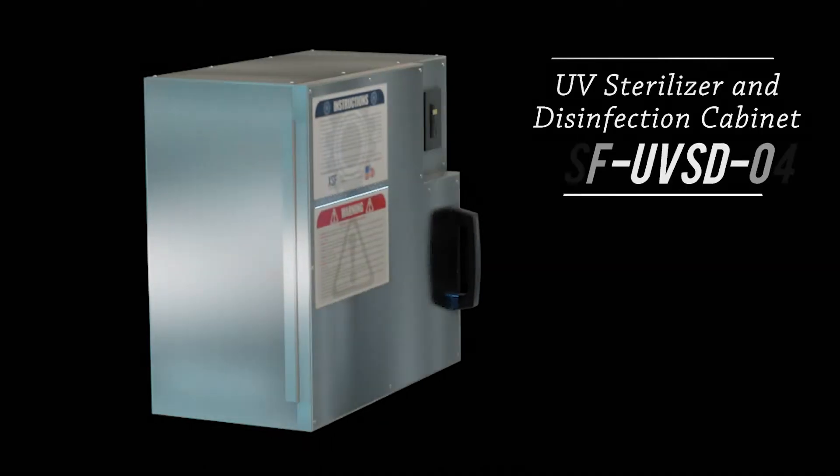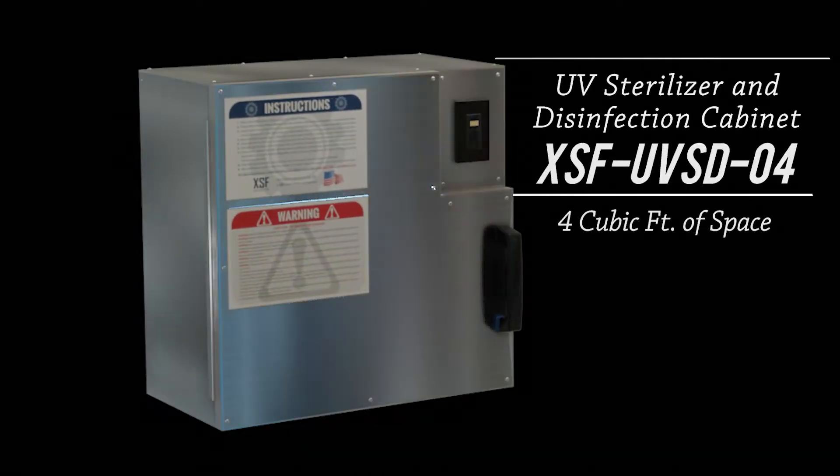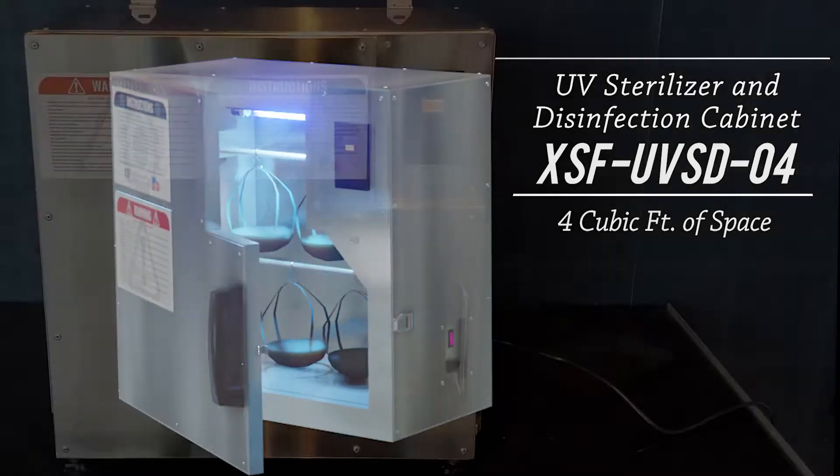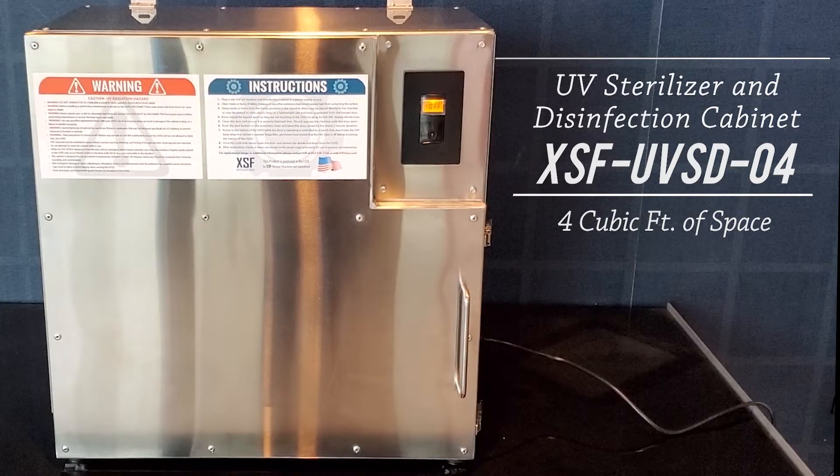This is a video on how to operate the portable XSF UVSD04 Sterilizer and Disinfection Cabinet. The UVSD04 has 4 cubic feet of internal disinfection space.